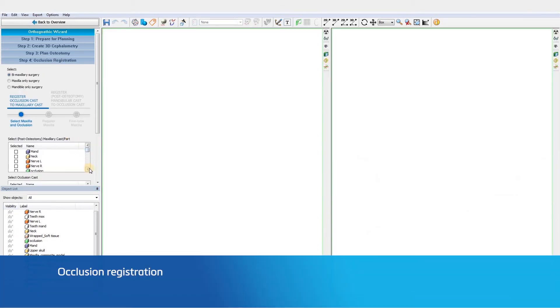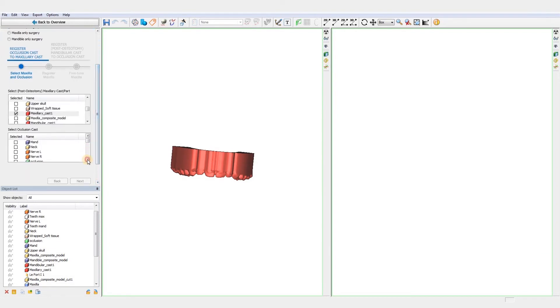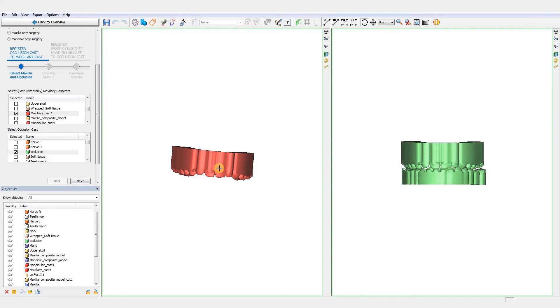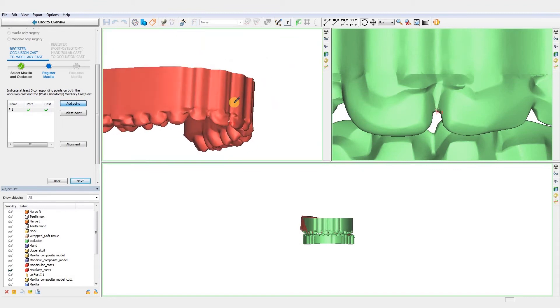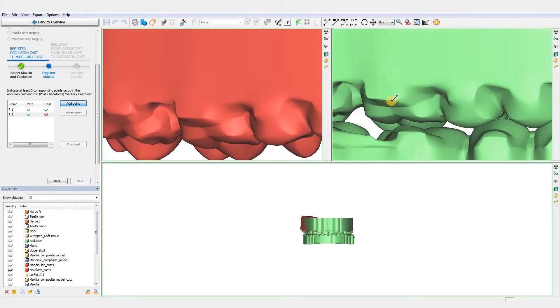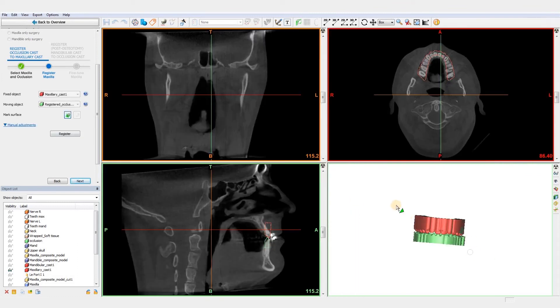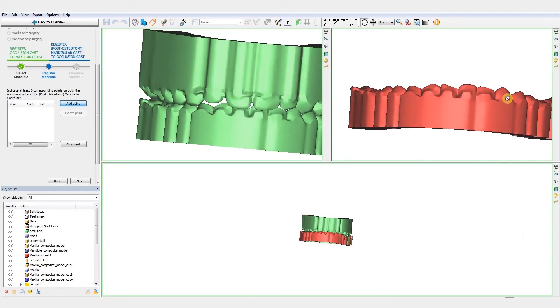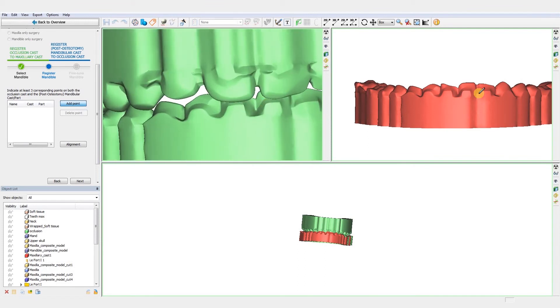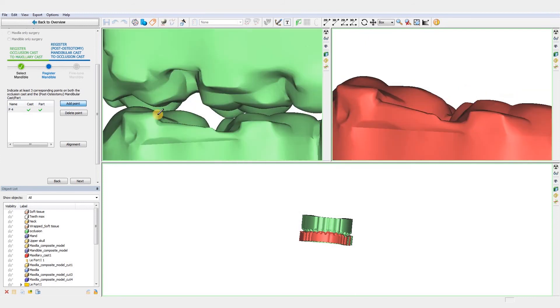At this point, we are now ready to set the final occlusion. We can either set the occlusion virtually or with the help of an occlusion scan. In this case, we have an occlusion scan, so we are going to merge the occlusion scan with the cut maxilla and the mandible. Starting with the maxilla, we choose identical points on the cut maxilla and the occlusion scan to register the parts. Then, we perform the same operations to register our cut mandible to the occlusion scan. Finally, the mandible is positioned in the final occlusion with the maxilla in its original position.